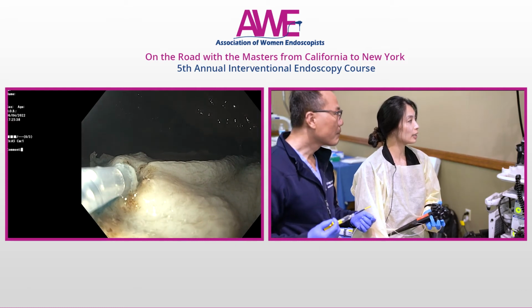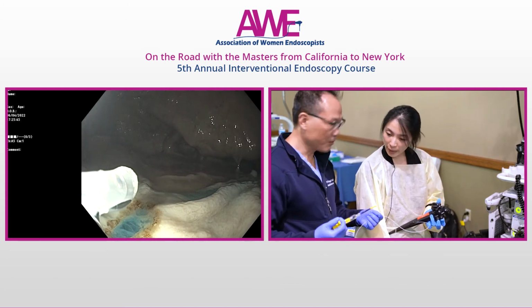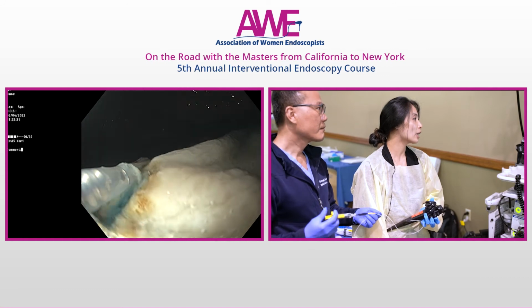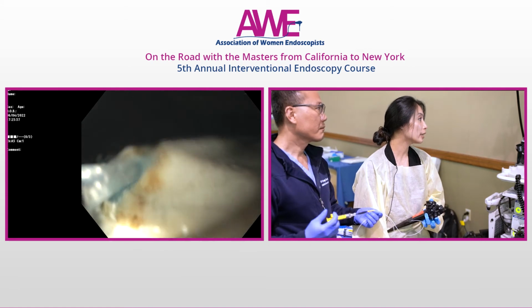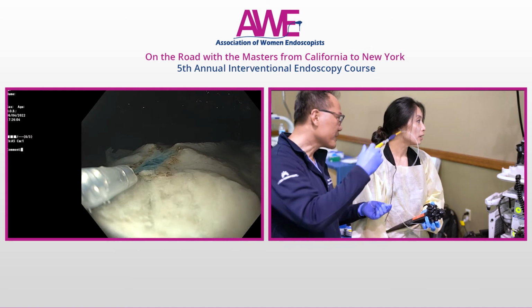So could you just give me a little blob there? This might not have blood, so it might not actually form a gel. Is that Purostat there, or did we prime with water? It is Purostat, yeah. So because this isn't blood, it's not coming out in the jelly-like format. But what we would do is just start from distal and slowly move. I'm moving 1 millimeter at a time, and he's just injecting a little bit at a time.